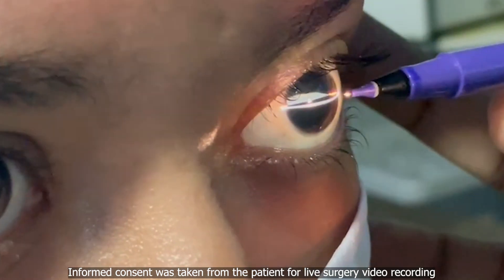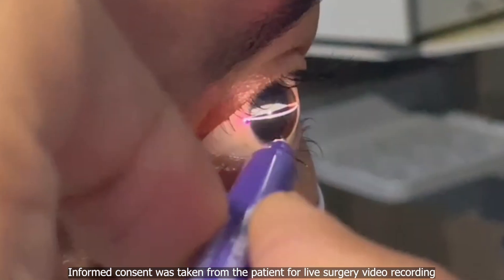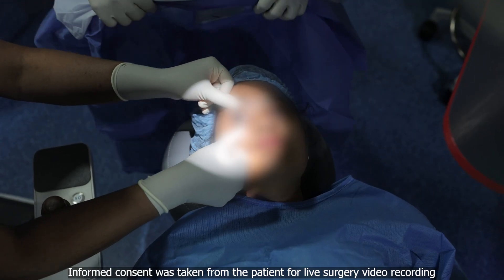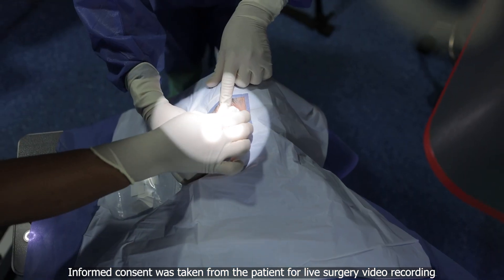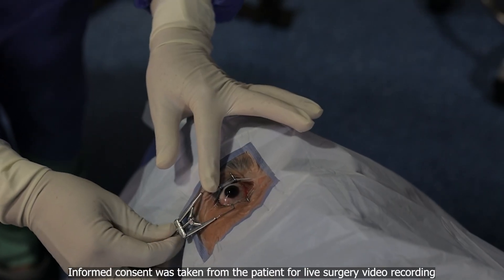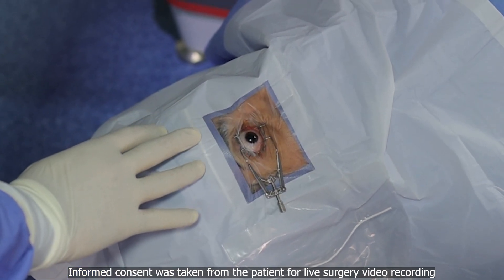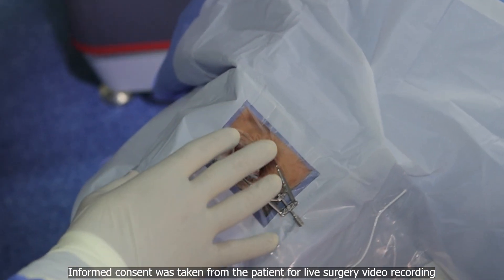Before draping the patient, we mark the 0–180 degrees on the slit lamp, which helps in cyclotorsion compensation. Using all aseptic precautions, the eye is painted and draped. One drop of topical anesthetic is instilled. Eye speculum is placed. We need to ensure that the lashes are completely covered and that the eye is properly exposed, which allows us good docking.